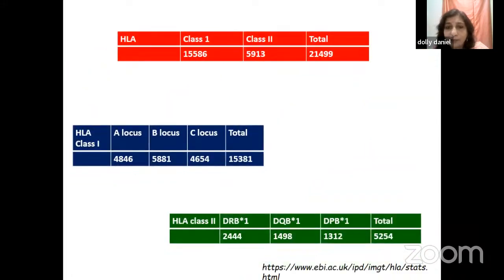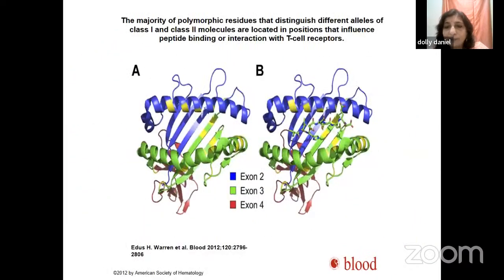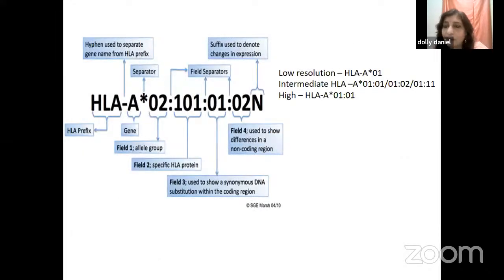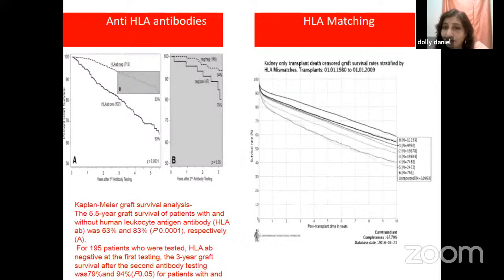As shown by Professor Briggs, the polymorphism of the HLA locus just kept increasing. But we also knew that with the structure of the HLA molecule, there were a lot of permutations and combinations which allowed differences to be acceptable. And for this, yes, we knew we would need sequencing, but we thought it was time we moved into molecular testing. We're all aware of low and high resolution. And while we couldn't get straight into it, we thought we should move down the molecular path.